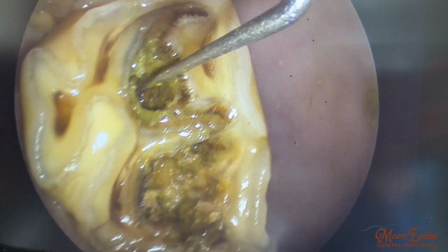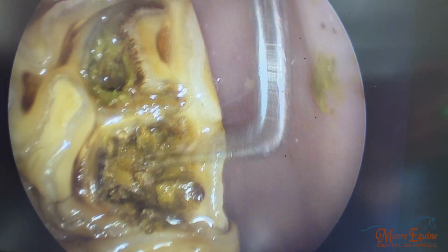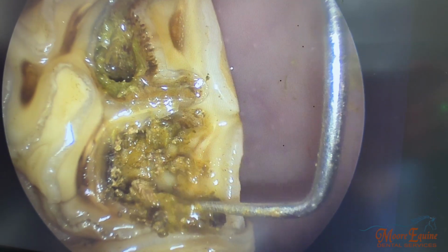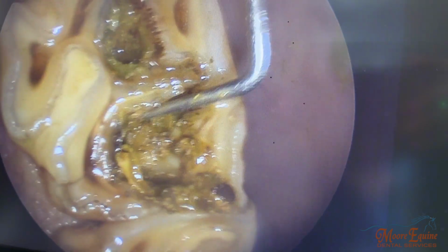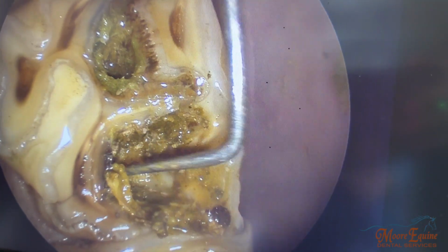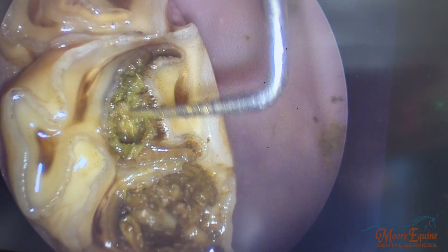You can see this piece just fell out. And so this tooth is structurally very weak and at a high risk of fracturing. So it's very important that we repair it, and that way we can add many years to this tooth. Infundibular restoration is just a great procedure for helping horses hang on to their teeth longer.